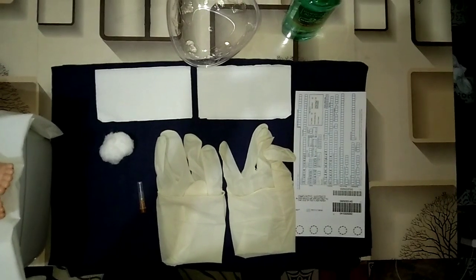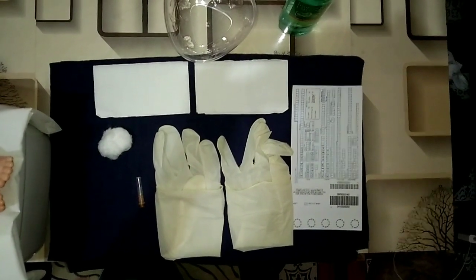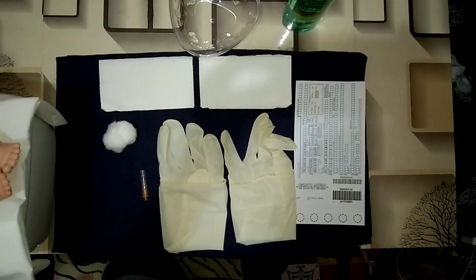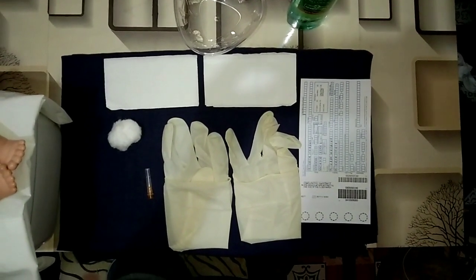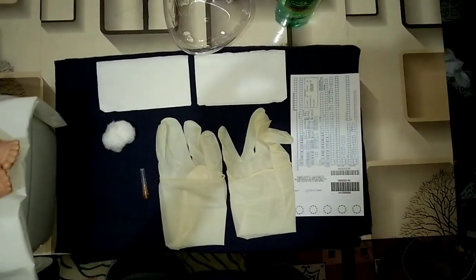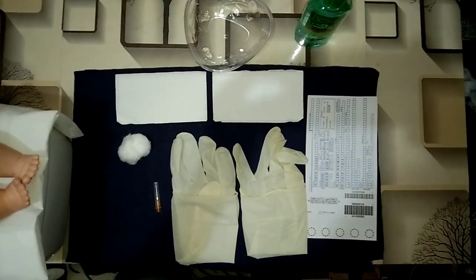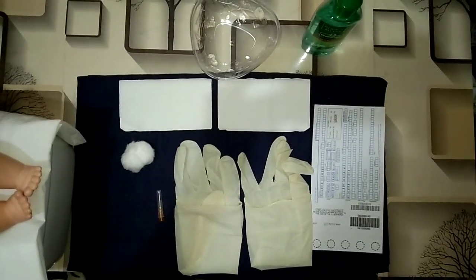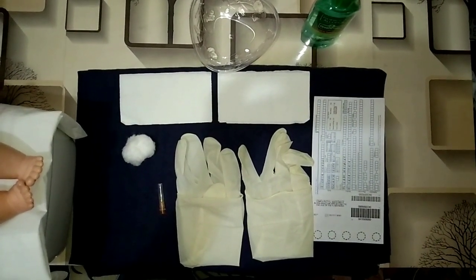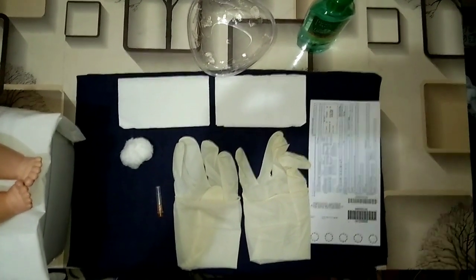After getting a sterile tray, we will be putting a pair of sterile gloves, a sterile gauze pad, a cotton ball dipped in alcohol, a needle that will be serving as a substitute for our lancet, the filter paper, which is filled out with accurate information of the infant, as well as the expiration of the filter paper was also checked. A bowl that contains warm water, which we'll be using to warm the heel of the patient before doing the procedure, and of course an alcohol that we will be using for sanitation.